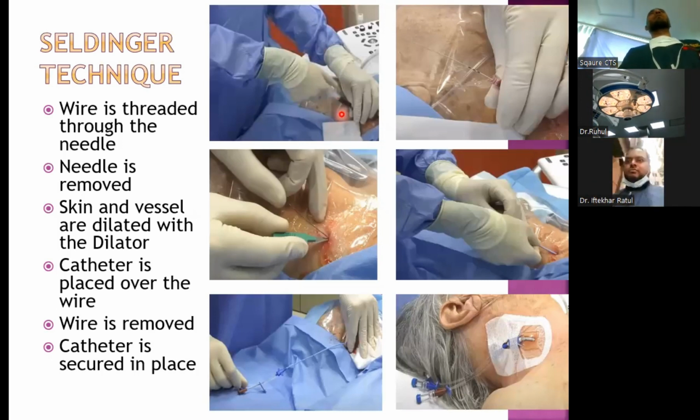After puncturing and confirming that the vein is punctured, the wire is threaded through the needle almost 15 centimeters, not more than that, because there may be a start of cardiac arrhythmia. Then the needle is removed, and the skin and vessels are dilated with the dilator, after a small cut in the skin.